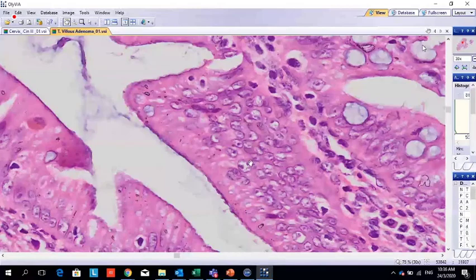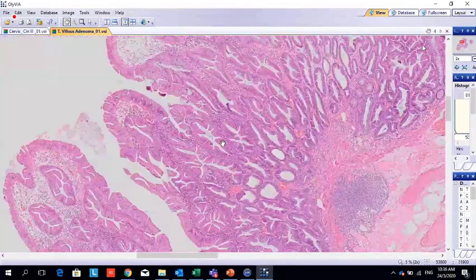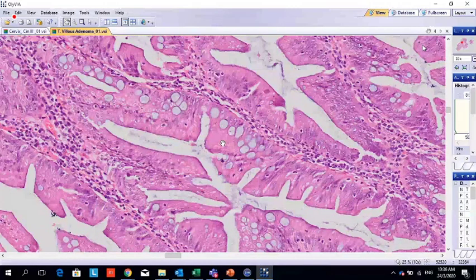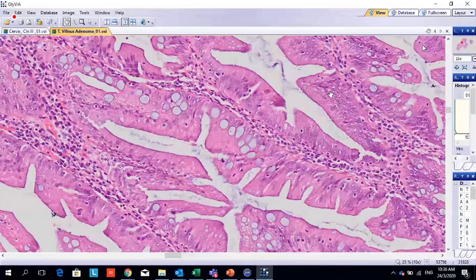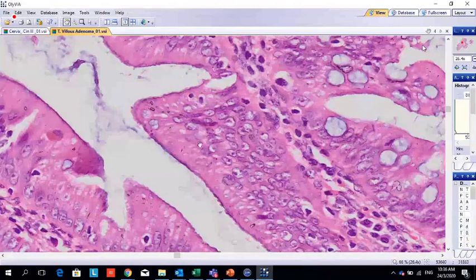Can you see there? Doctor, what are those cells? The ones we just talked about, the goblet cells? No, you pointed at something else. This one, on the right? Yes, this is the more dysplastic area, see? No goblet cells here, only a few there.